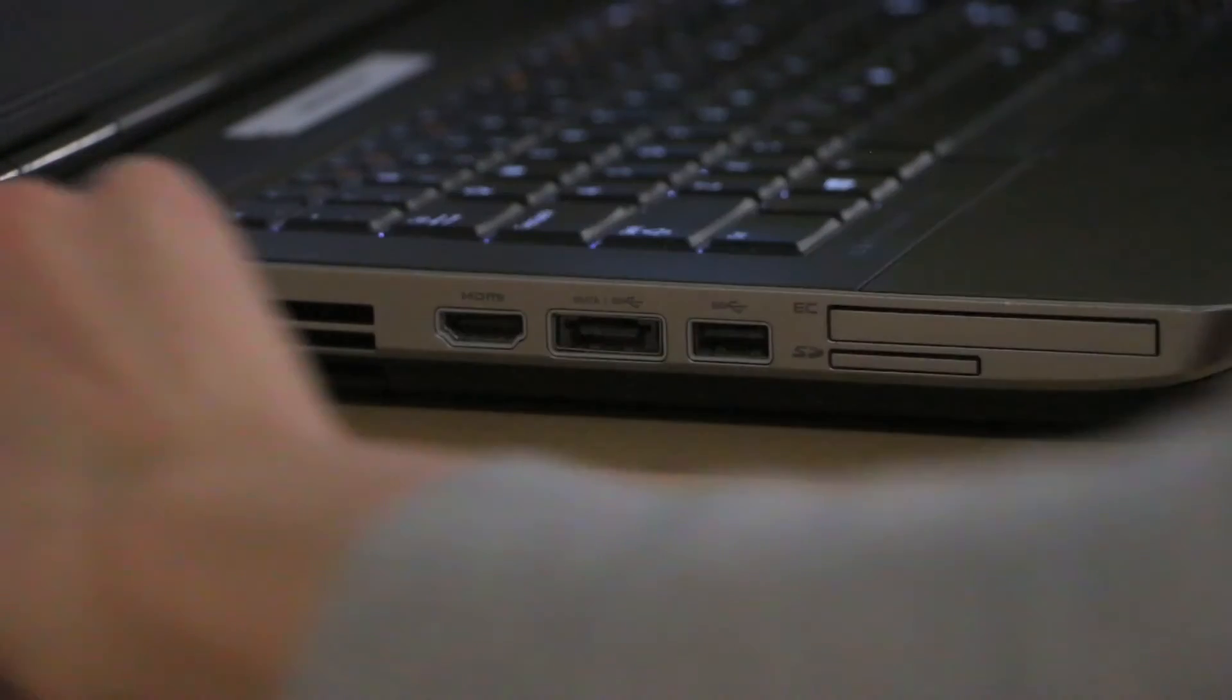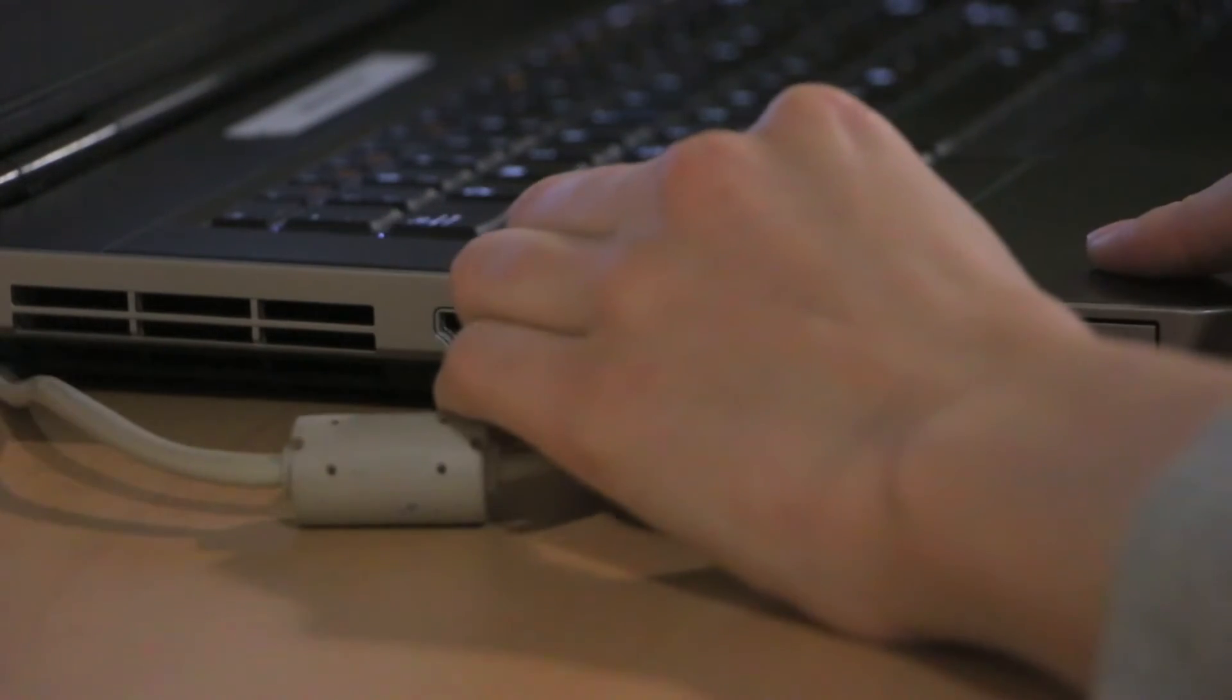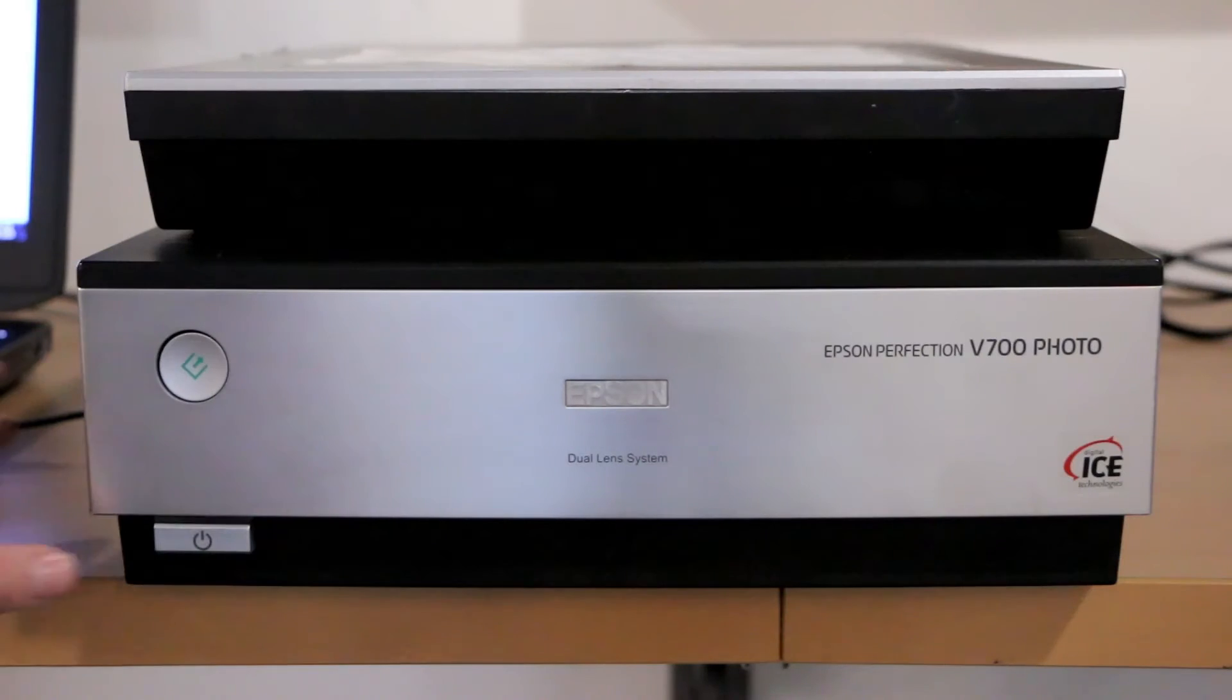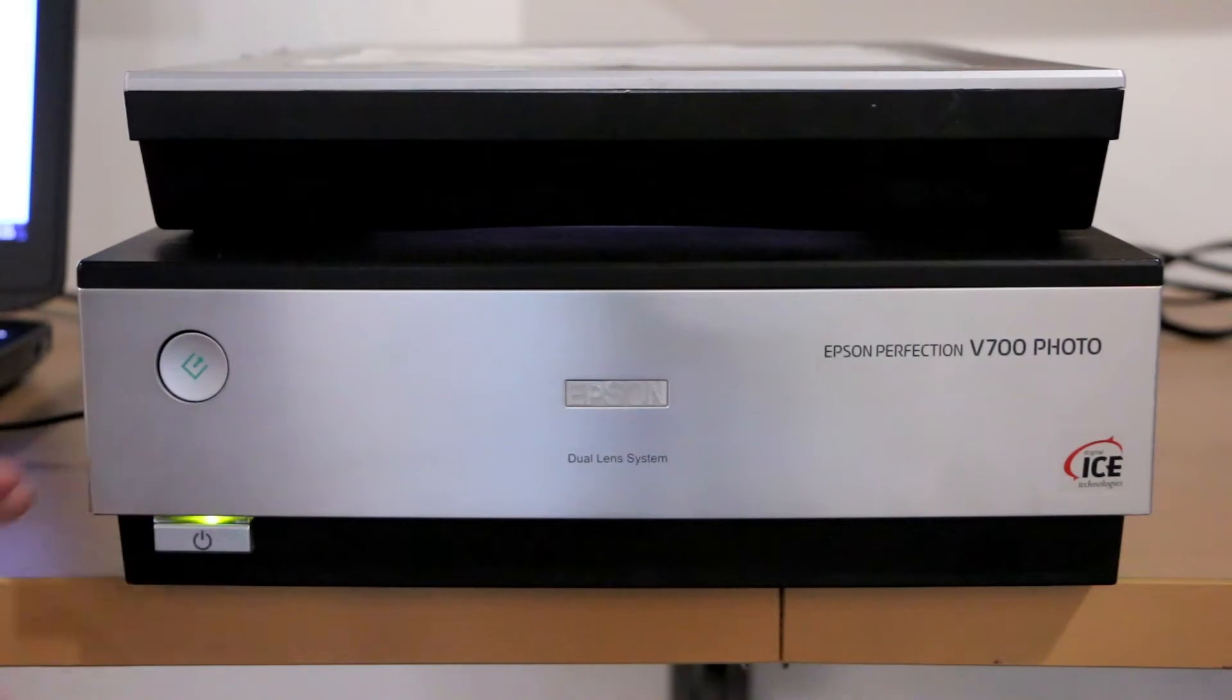First, plug the scanner USB cord into the laptop. Make sure the scanner is turned on.